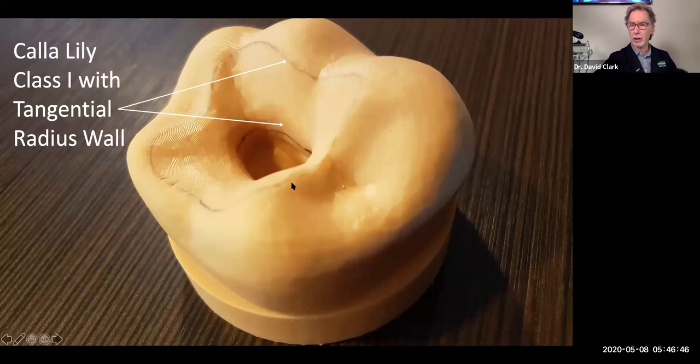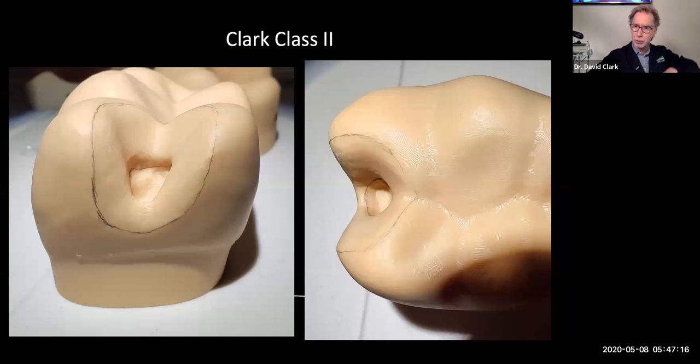So one of the things about this Clark Class 1 is it has this incredibly large tooth restoration interface. So if we're going to be successful with selective caries retention, we have to maximize our external seal. The neat thing is that selective caries retention and these Clark preps, because they have such an incredible external seal with so much surface area, go hand in hand. You can't do selective caries retention without an incredible external seal. So this is the Clark Class 2, once again with the radius walls that allow a maximum interface of the composite to the tooth with a low C factor. We've been doing this now for a decade with incredible results. But at the end of the day, if we cannot have a good restorative seal, if we can't put the tooth into compression, if the tooth is flexing and uncomfortable, then the tooth is going to end up needing endodontic therapy. So these are key.